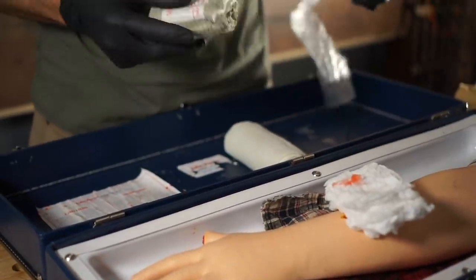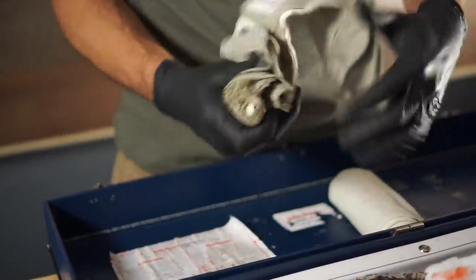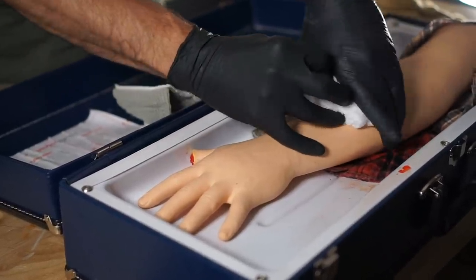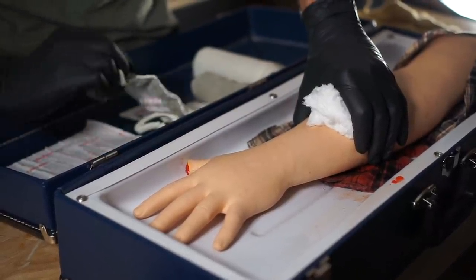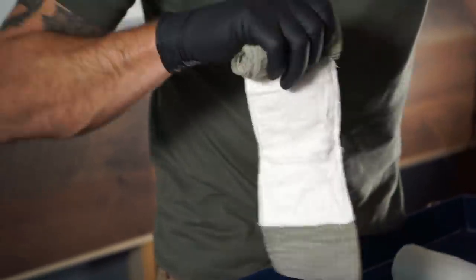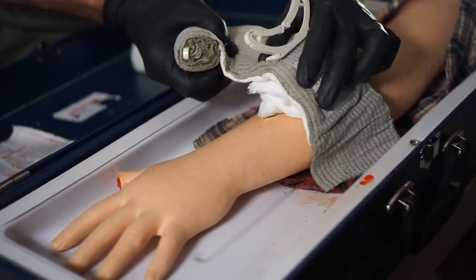Here's a look inside the course showing you how to put on an Israeli bandage. The Israeli bandage has a dressing built in and it's also elastic, so it works really well for this. Once I've got that wound packed and I'm using an Israeli dressing, I want to maintain pressure on there and replace manual pressure with this pressure dressing. When you open this up, you're going to have a cleat and a reasonably sterile field that you place directly over the wound. You want that cleat to be directly over the wound as well.